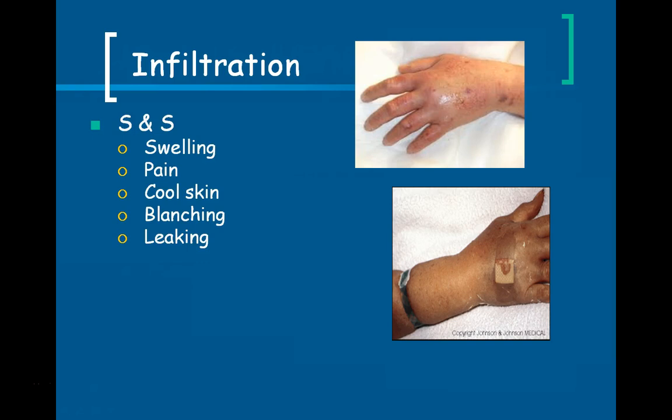So, signs and symptoms of infiltration. Well, the area gets swollen and the skin becomes very tight looking, as you can see in these two pictures. It's not edema, it's the IV fluid that's in the tissue, and so you may see swelling. Oftentimes the first symptom that the patient will have is that it hurts. They'll complain that their IV hurts, and we go in and look at it and their arm looks swollen.